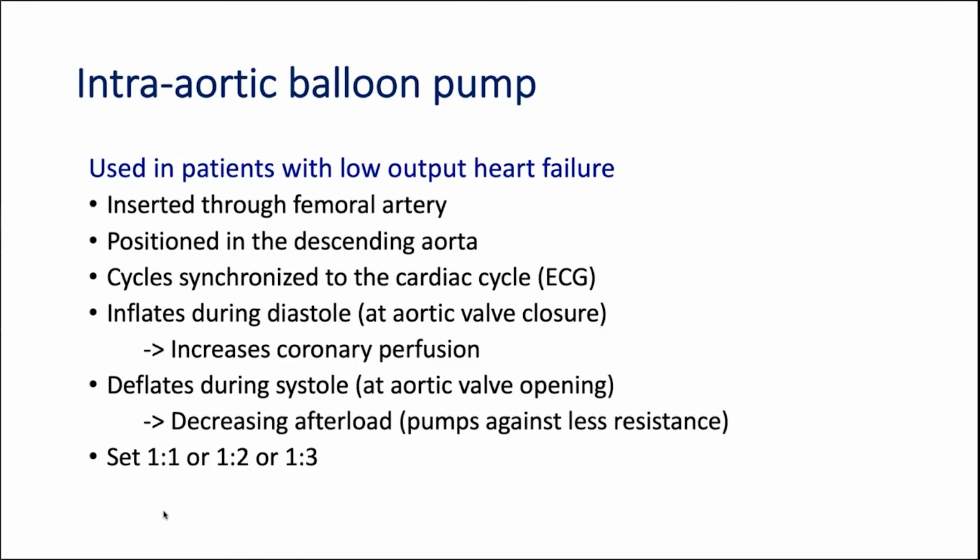Intra-aortic balloon pump produces some interesting flow changes in the carotid arteries. The intra-aortic balloon counterpulsation has sort of come in and out of practice over the years. I think it's kind of on its way back in some settings today. It's generally used for low output heart failure in individuals who may be having a coronary revascularization or maybe need a new heart. The pump is inserted through the femoral artery.